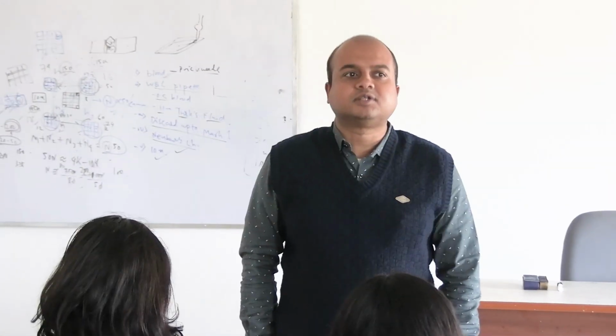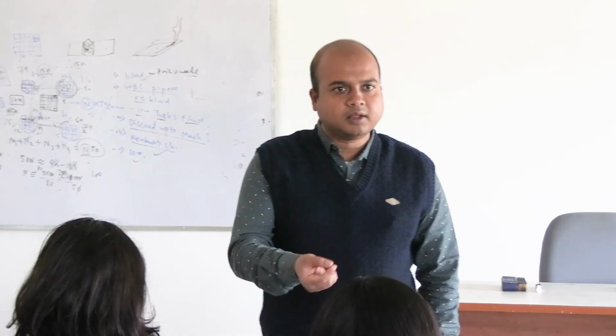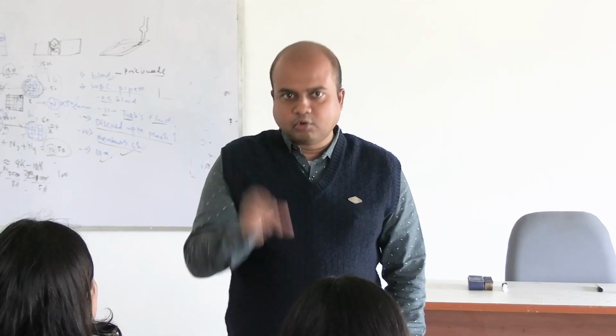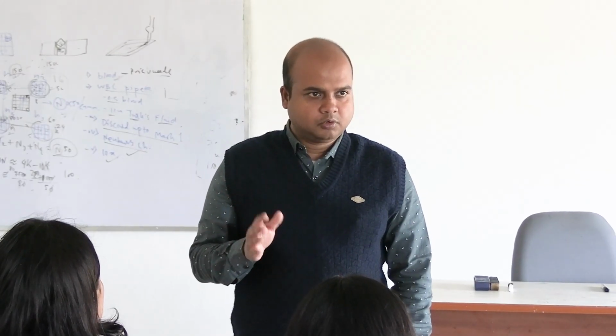That is 11 parts of volume, and 0.5 part of volume is blood, but 1 is discarded, which is below the bulb and is only fluid, containing no blood. When the fluid is pipetted, it is pushed up along with the blood in the bulb. So, below the bulb is only the fluid. Do you get it?